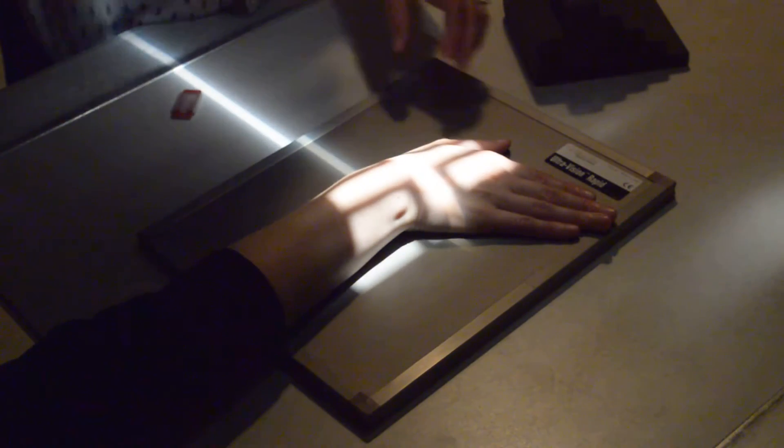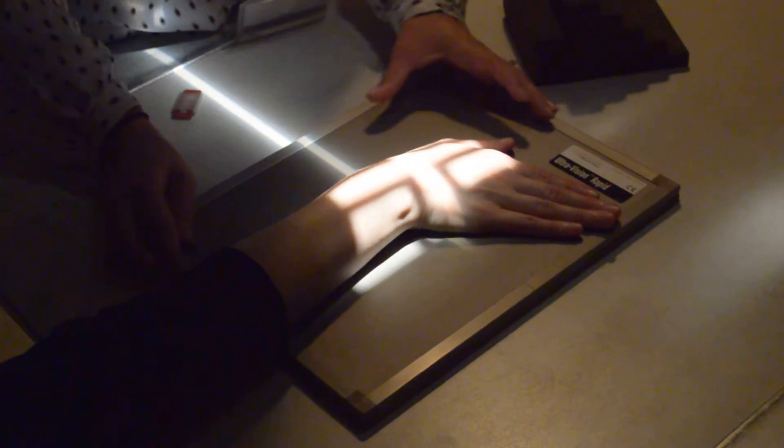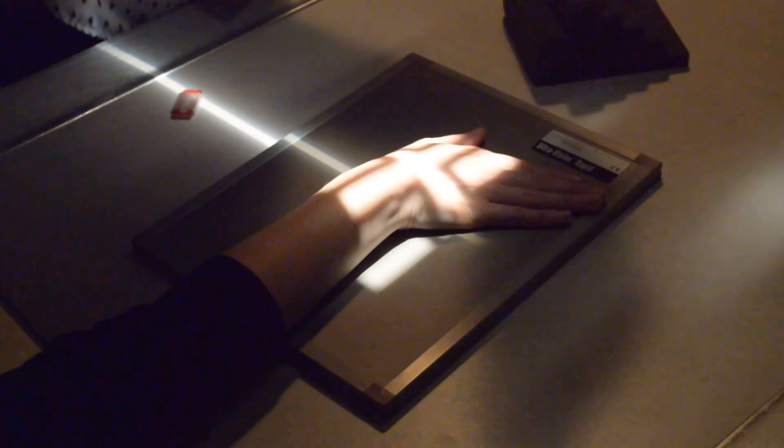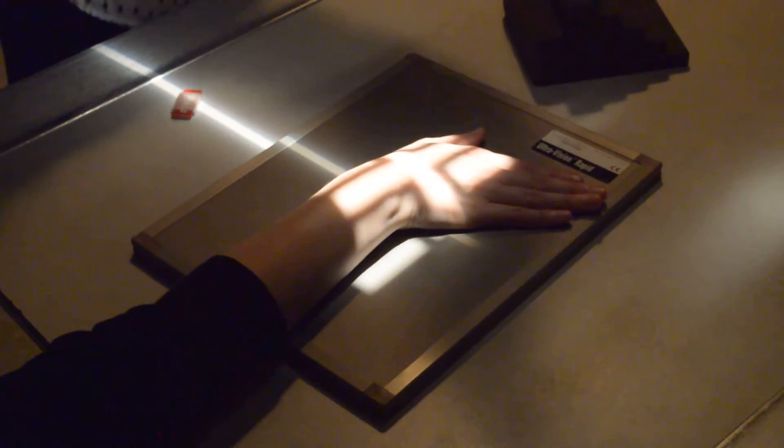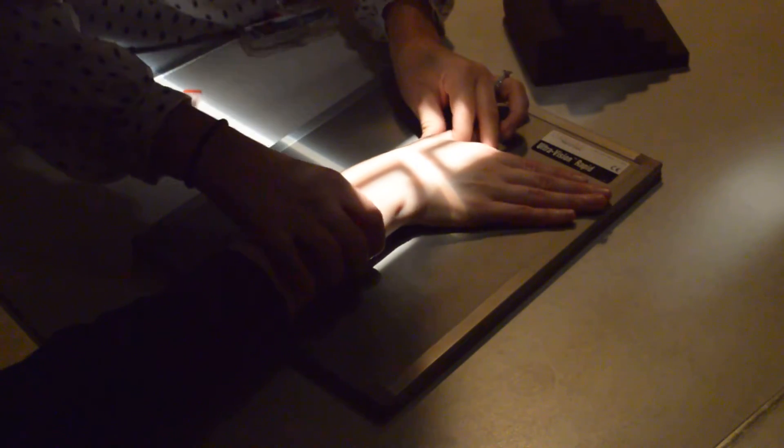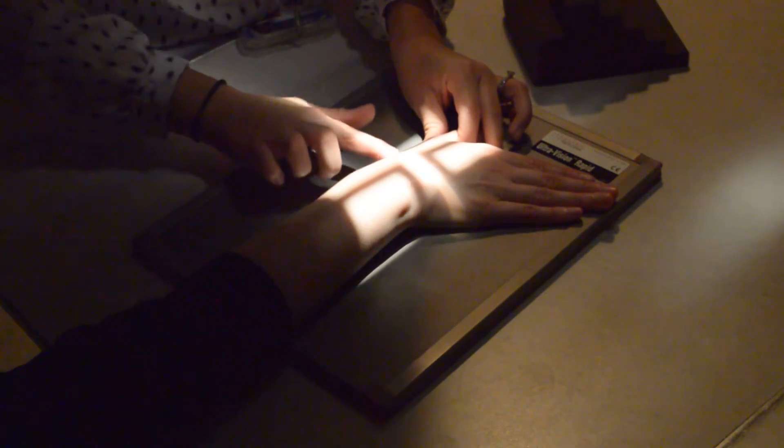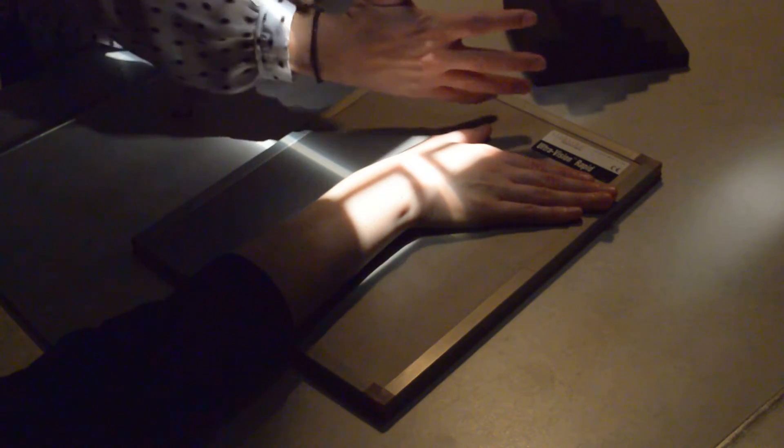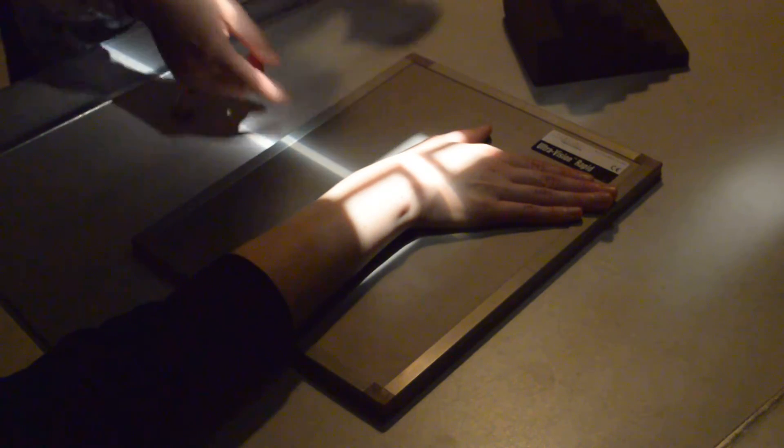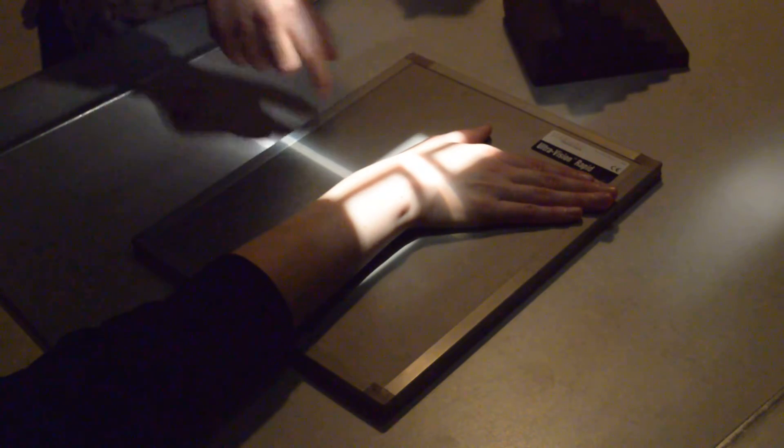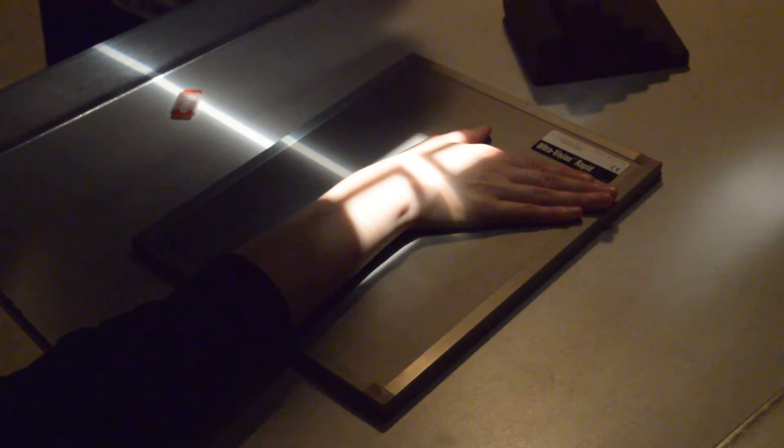And then when you center for this, keep long axis with long axis. And you want to be centered right over the scaphoid. So where you see the little divot in your hand when you relax is approximately where your scaphoid is. So you'll be centered over that. And then you can collimate down a little bit more on this.